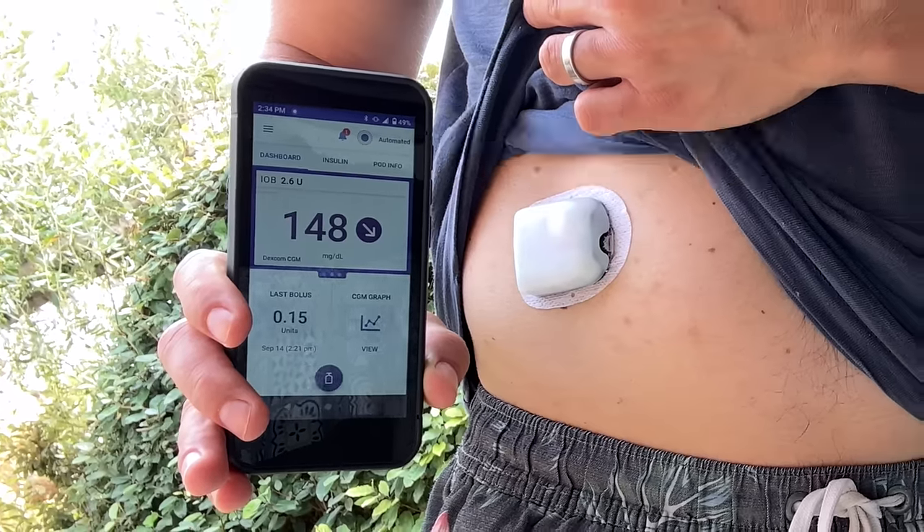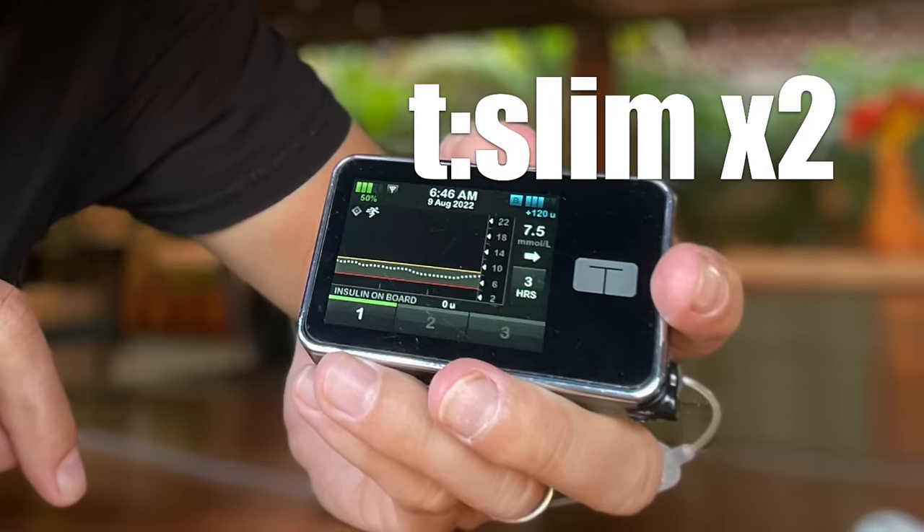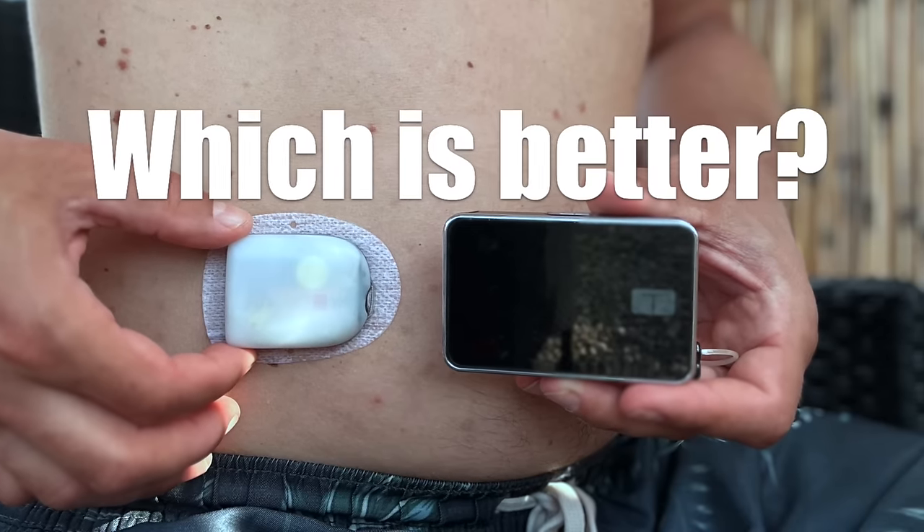The Omnipod 5 from Insulet or the T-Slim X2 from Tandem — which of these two insulin pumps is better? I've used the T-Slim X2 for three years and the Omnipod 5 for the last four months, and I can honestly tell you they are both amazing, but also very different. This video will help you decide which system is better for you, and I will share which one I pick.